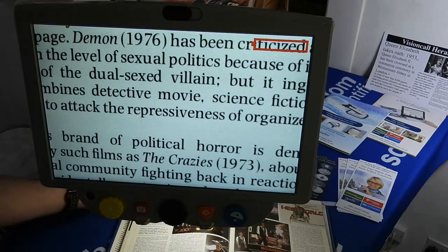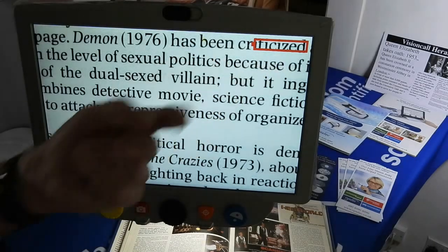The power button is just on the left-hand side where the power adapter is, and there is a flashing green light because the unit is currently charging.